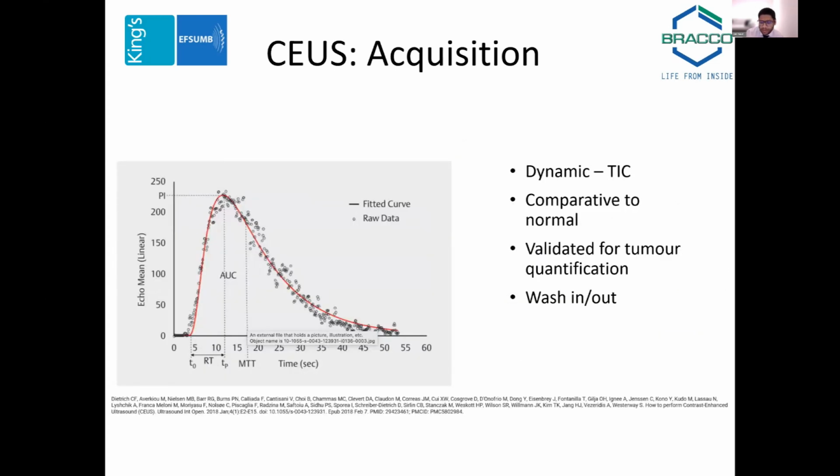It's also important to do the video acquisition because it might allow you to do time intensity curves. Many of the machines now have this built in, and certainly there is software like ViewBox, which allows you to map the points on a pre-acquired video image and determine whether or not your lesion is hypo-, iso- or hyper-enhancing in a quantifiable method. And whilst this isn't in day-to-day practice as yet, it certainly is something that is used for research.